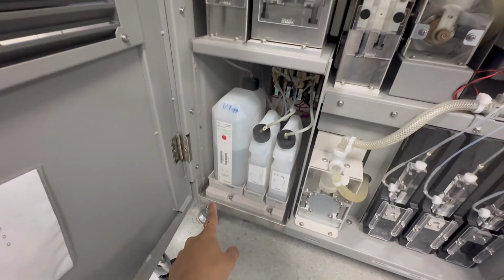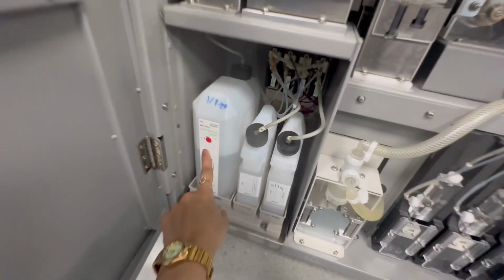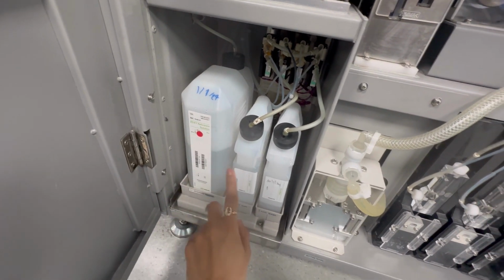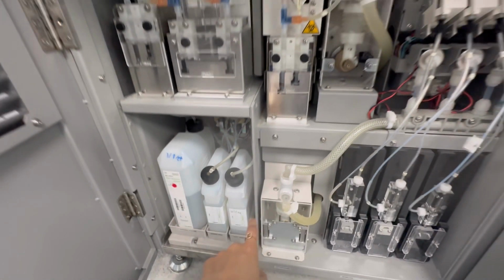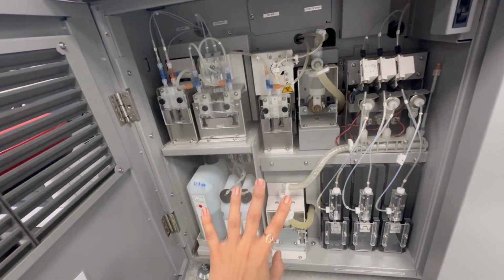This is ICT solution which will be used by the machine itself for the chemistry purpose. ICT solution, acid wash and alkaline wash. These are the washes which we will be using in the biochemistry side. Okay, this is about the list of supplies which we will use.